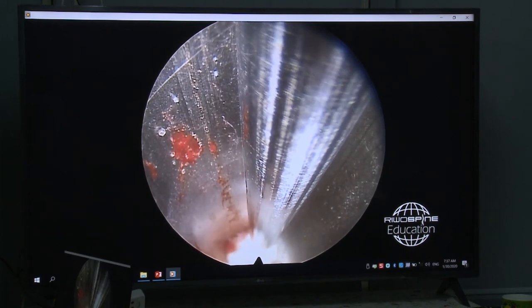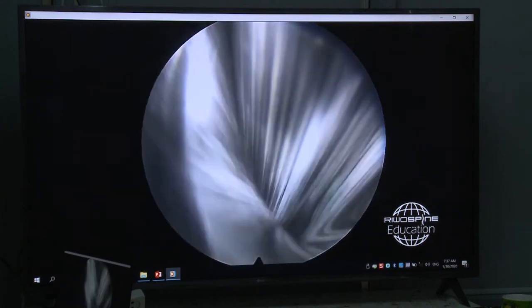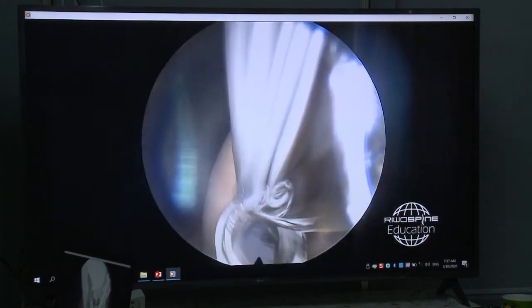Only the cannula, not the endoscope. I think it will stop bleeding now.